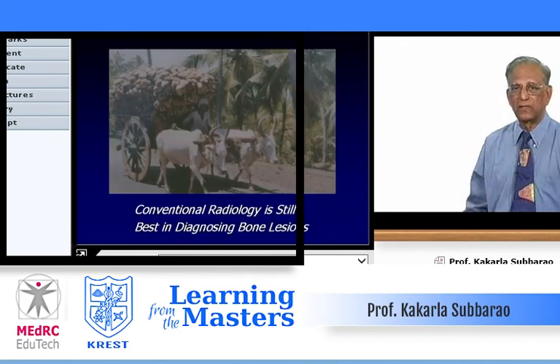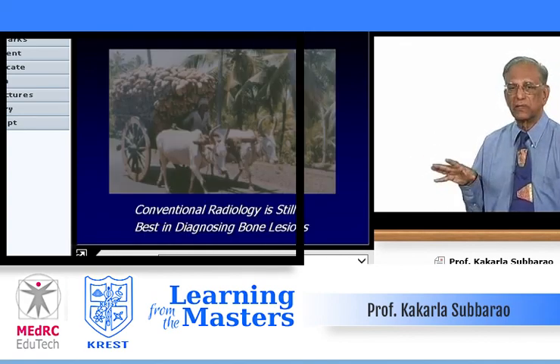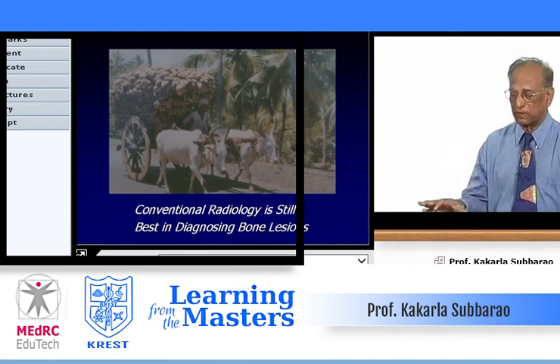I emphasize this point, conventional radiology is still best in diagnosing bone lesions.